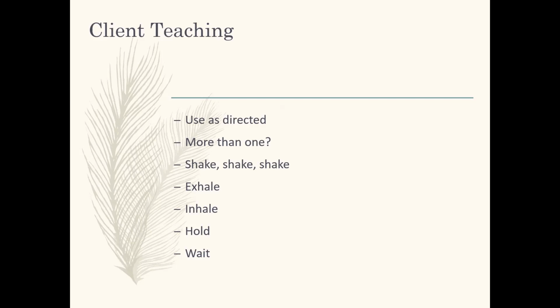Another key point is not just that inhale, but they want to hold their breath. If they can't hold for 10 seconds, hold it for 8 seconds. If that's all you got, that's great. By holding that medicine in there, you're allowing the medicine to have more time up against the inside of those respiratory tract airways. The more time it has, the more time it has to work, the more time it has to cross over that barrier. So we want them to hold their breath, right? That way more of that medicine can get in there, float around, really work.